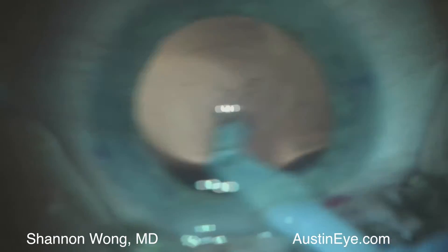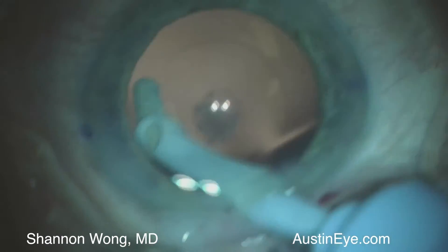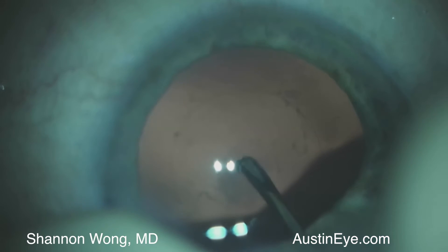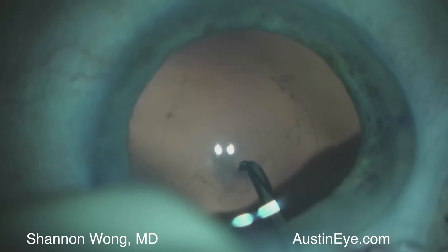At this point in the procedure there's a posterior capsular plaque that cannot be removed despite aggressive manipulation using the silicone tip irrigation and aspiration tip. We use a cystotome and you can see there's a reflection in the posterior capsule showing that the plaque is fairly fibrous.